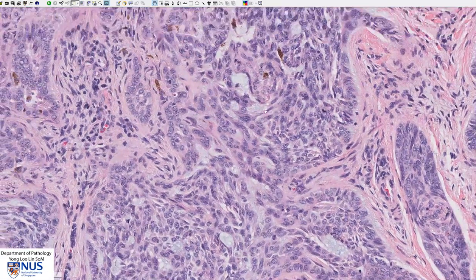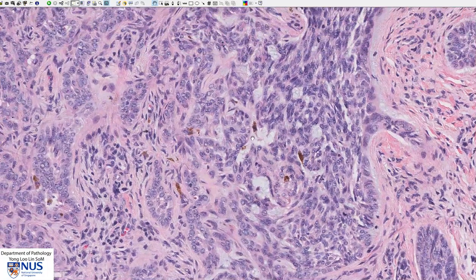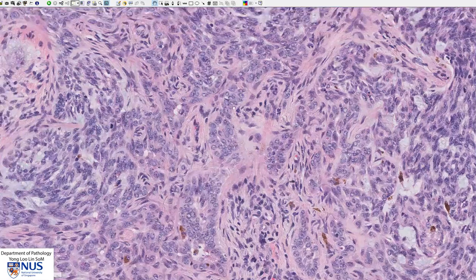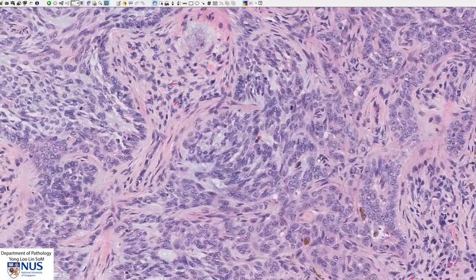Looking at higher magnification, we also see occasional pigment-containing macrophages. This is melanin pigment. Sometimes the tumour cells can also be pigmented, giving rise to a brownish or dark brown appearance on the skin, which can mimic melanoma.